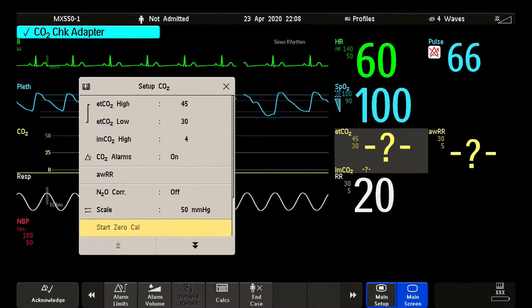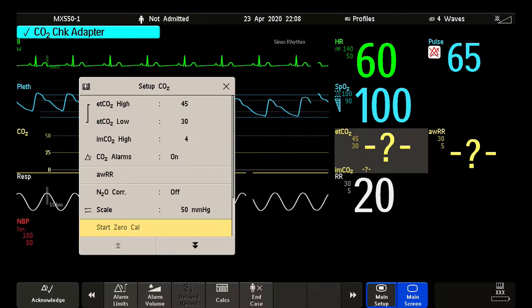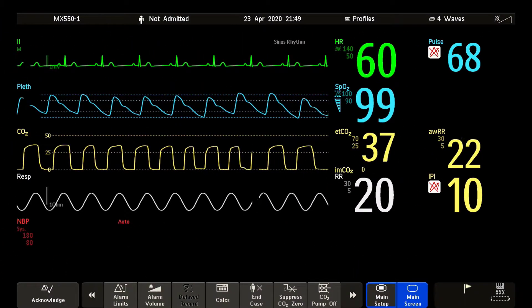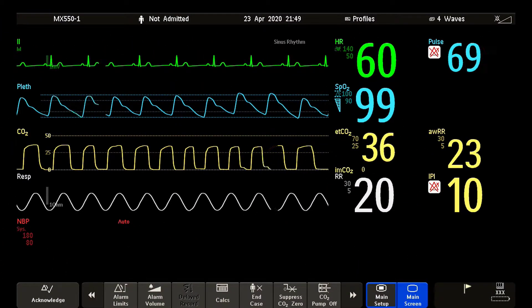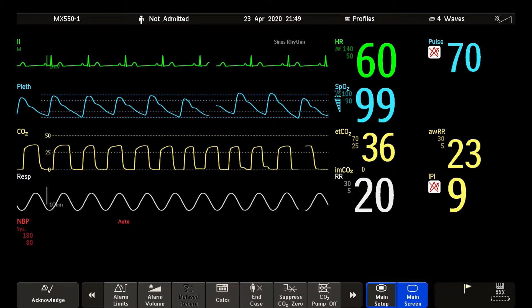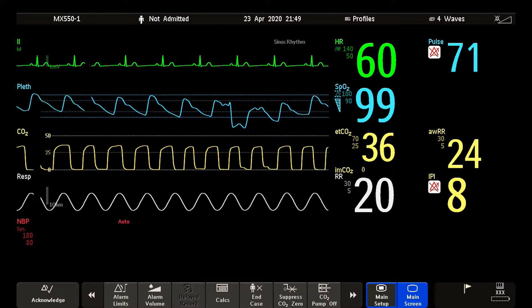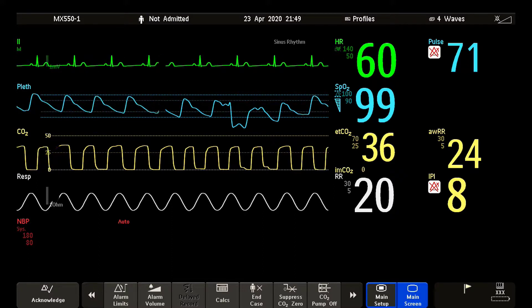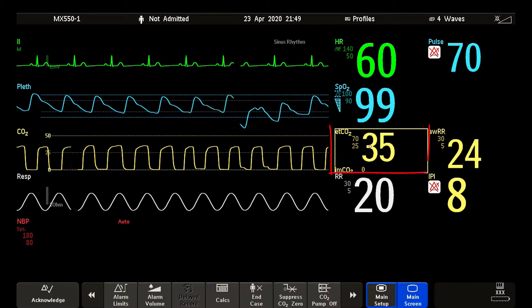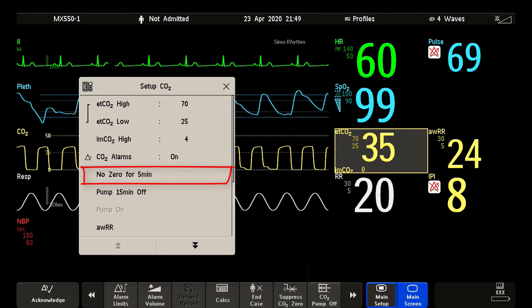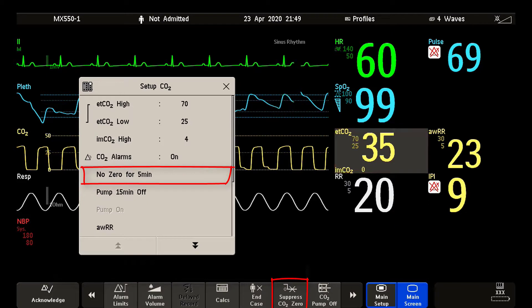For some CO2 technologies, you need to perform a manual calibration. In the Setup CO2 menu, select Start Zero Cal to initiate. When using sidestream technology that has automatic zero calibration, you can prevent an automatic zero calibration from being started in the next 5 minutes by selecting the Setup CO2 menu, then selecting No Zero for 5 minutes, or by selecting the Suppressed CO2 Zero Smart Key if configured.